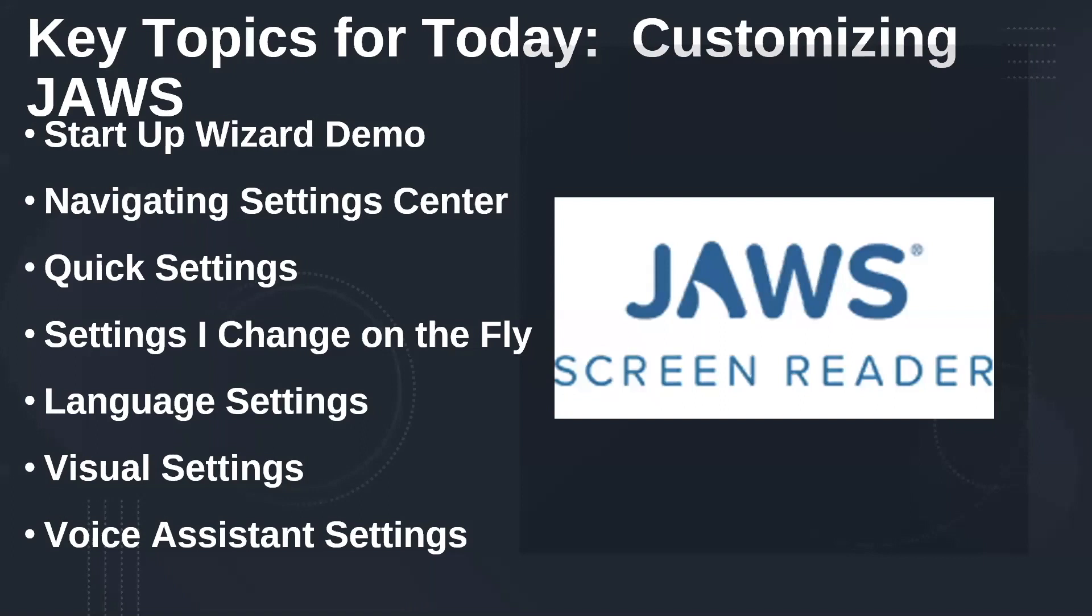So you can change settings for speech rate, punctuation, typing echo, starting JAWS at the login screen, just a wide range of things. Now the Startup Wizard runs when you first install JAWS. But anytime after that, you can also press insert J to go to the JAWS window, Alt H for the help menu, and then Z for Startup Wizard.